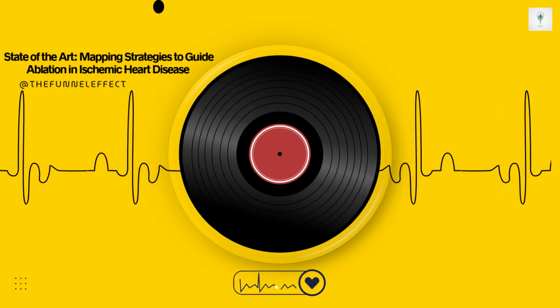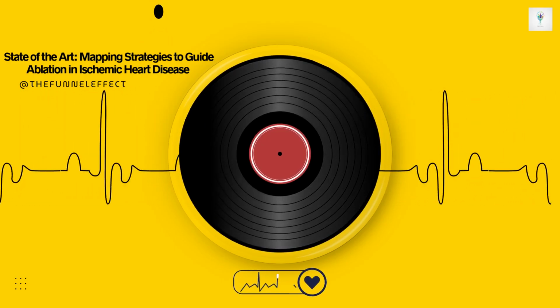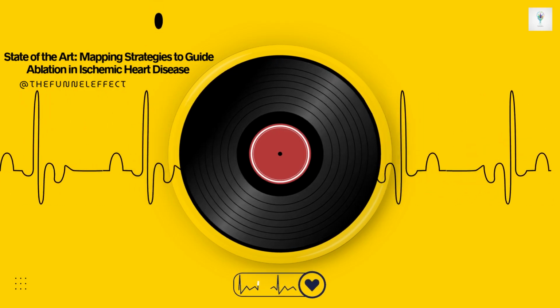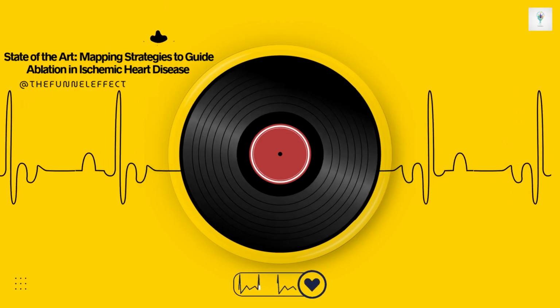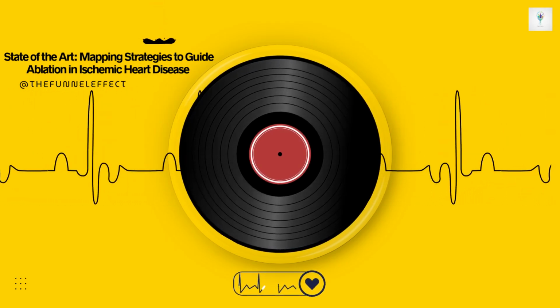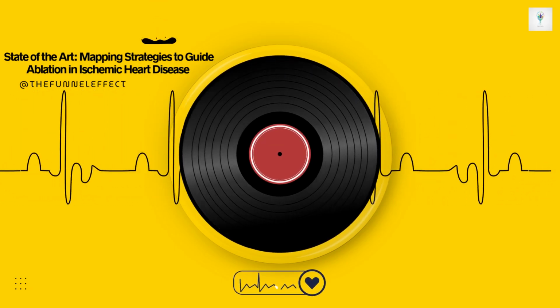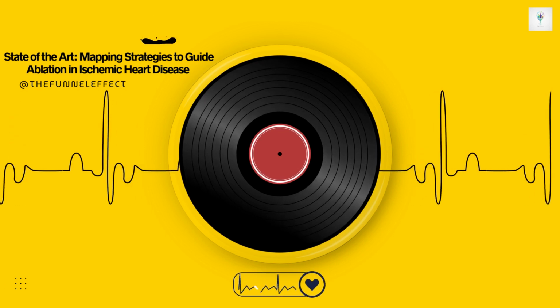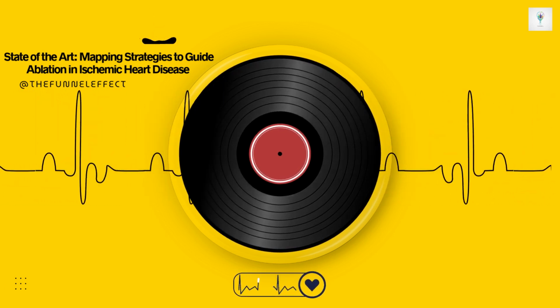So, if the critical pathway is deep, and our standard ablation catheters deliver energy that only penetrates maybe 3-5 millimeters, we might not be able to effectively reach and destroy that deep isthmus, even if we know where its entrance or exit is. That's the core problem. You can ablate the entrance, you can ablate the exit, but if the critical segment is 6 or 7 millimeters deep, standard RF ablation from the surface might just not be sufficient to render it non-conductive.